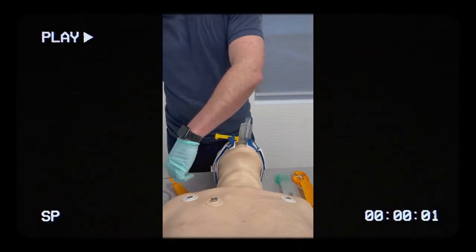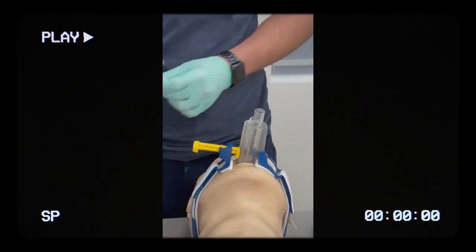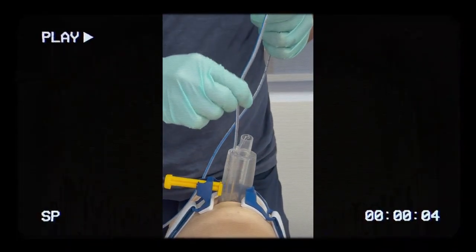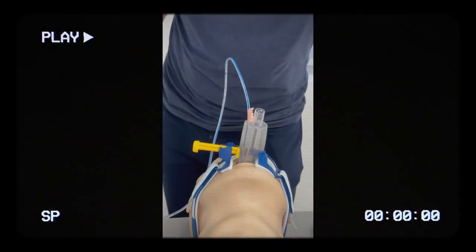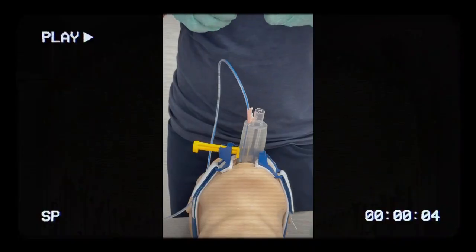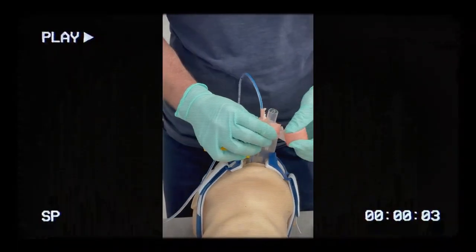If you didn't mark your spot, you'd forget how far to go while inserting, so it's recommended to put pink tape to mark your depth. Afterwards, get your lubricant and give a small bolus of lube to the actual gastric port. Then take your catheter, prime it multiple times, and insert it to reach your marked depth.